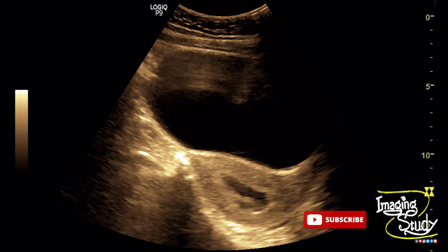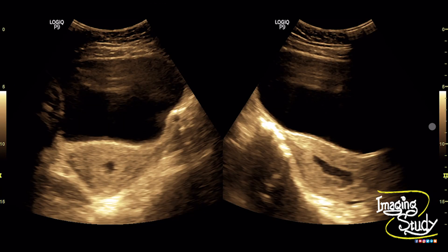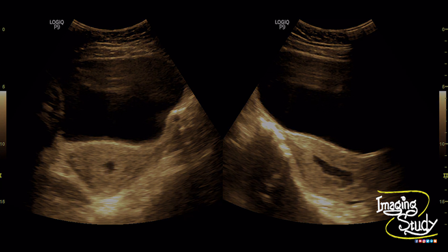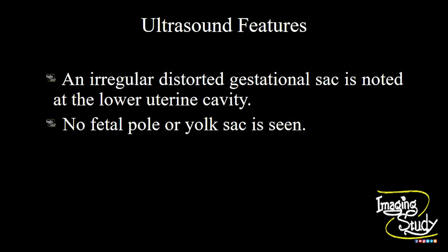Here again the longitudinal and transverse sections of the uterus show the irregular distorted tubular gestational sac. In summary, an irregular distorted gestational sac was noted at the lower uterine cavity, with no fetal pole or yolk sac seen.